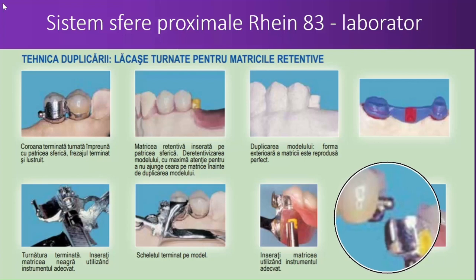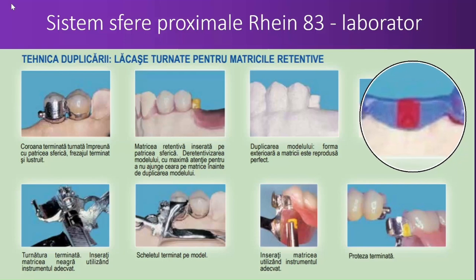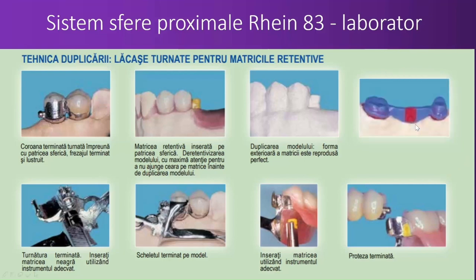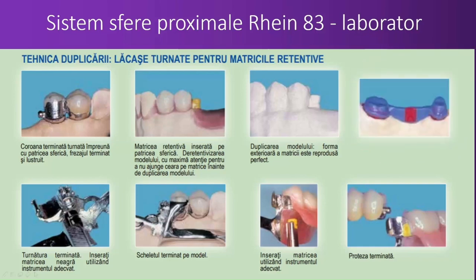And here is another solution. We can place this sphere on the lateral of a bar, but why would you do that? Well, that's another discussion. I would use a normal bar, but maybe the sphere being a little bit smaller. Anyhow, in lack of space, you could think about such a solution. I don't like it anyhow, but this is a possibility.